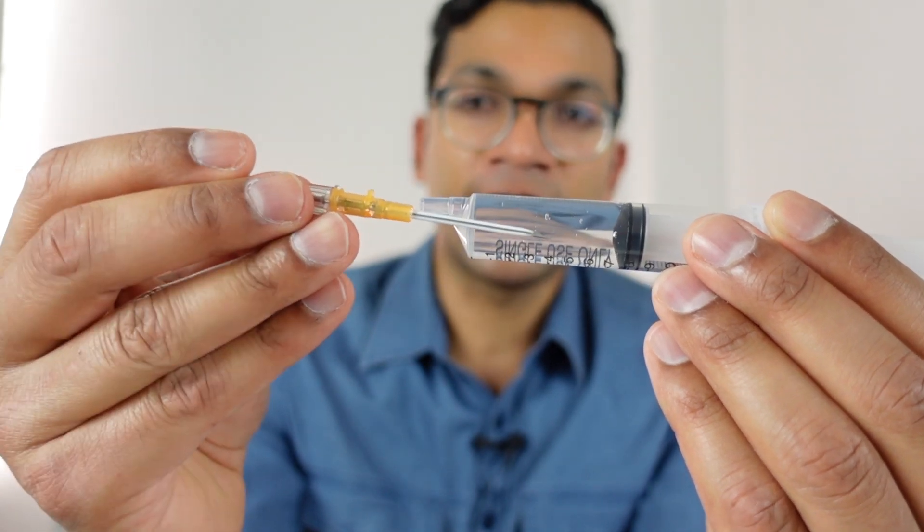If you go really really slowly and take your time, you get flashback and then you know it's time to flatten out and advance. Besides going slowly, a method passed down from my supervisors and seniors - and which I pass down to my juniors - is to put saline in the chamber of the cannula. This speeds up flashback because instead of needing a pressure differential between blood and air, you get flashback not just through a pressure gradient but also through diffusion.